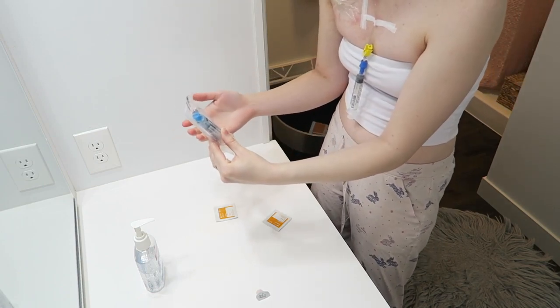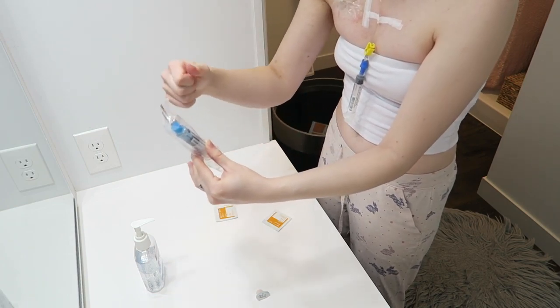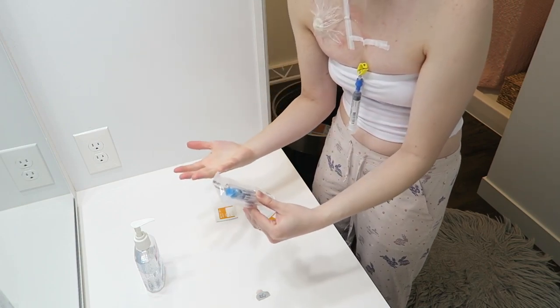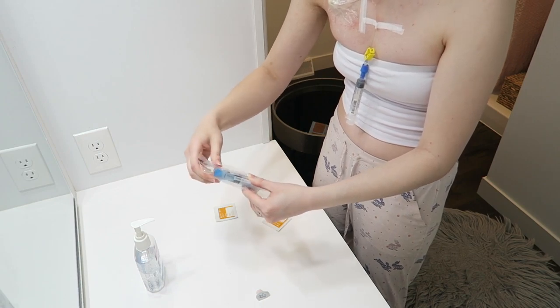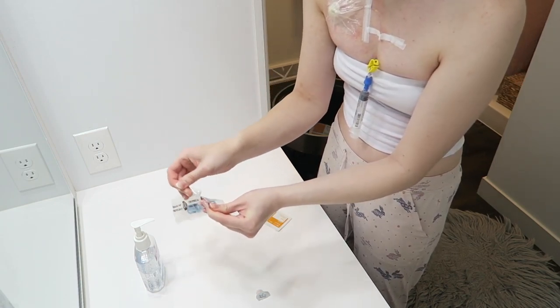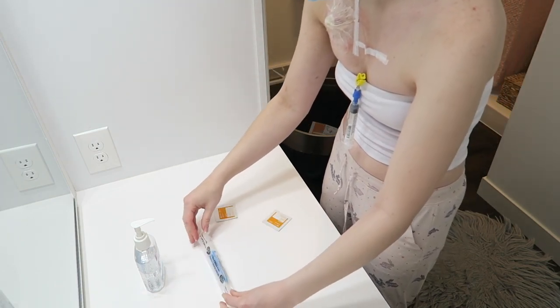The way that nurses teach you to do it, they take the whole cover off, put the cover upside down, pull back, prime, and then put the cover back on. That just causes a lot more potential for contamination or for bacteria to get in there, so this is just an extra precaution. Now I'm gonna go ahead and open this and have it ready.